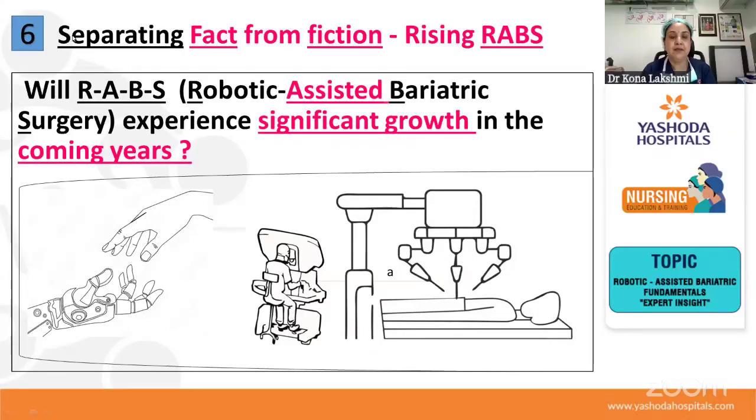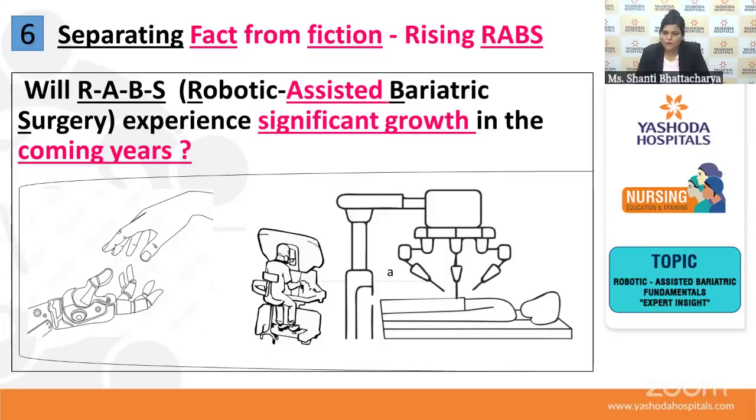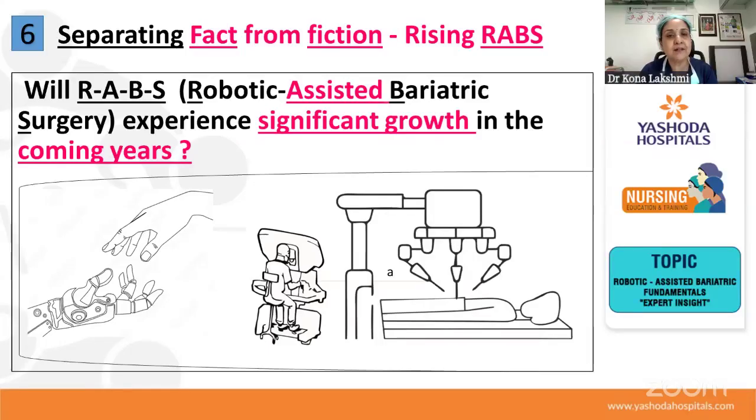When we started doing laparoscopic surgery, almost 2.5 decades back, when the laparoscopy or minimally invasive surgery boom happened across the world, we saw that for certain procedures there was always a certain degree of difficulty. That difficult part either needed a lot of experience, individual skill and effort, or people were saying that after this point we are not able to do it minimal access, we are opening the patient, because they were not able to tackle those critical steps.